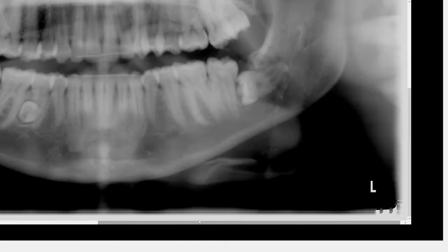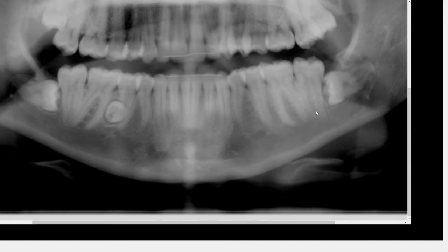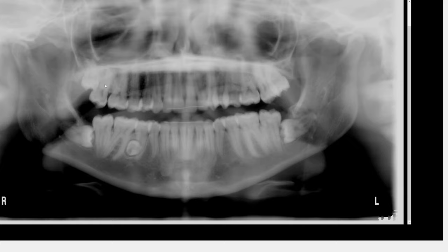Now you can guess why this patient presented to our clinic. The chief complaint was not the supernumerary or odontoma — that was an incidental finding the patient was unaware of. The patient presented because of headache and pain associated with the impacted third molar. The patient also has teeth number 1 and number 16, with 16 fully erupted and number 1 appearing partially erupted. I hope this was interesting — thank you for listening.